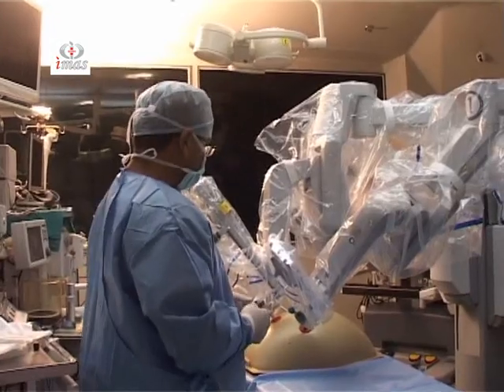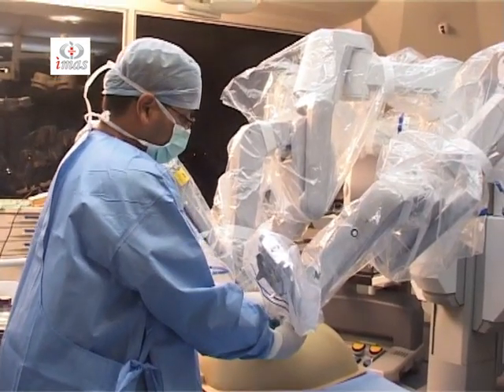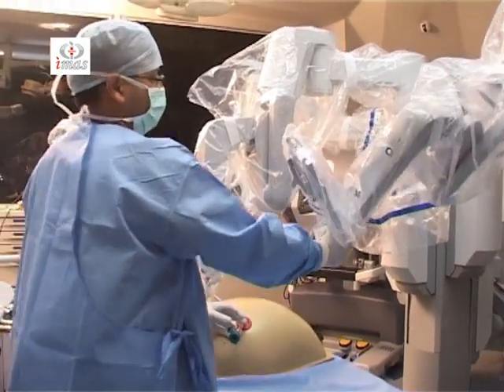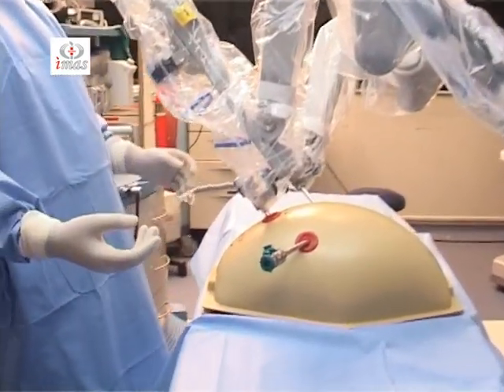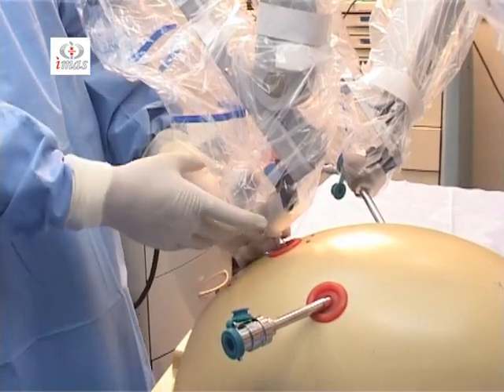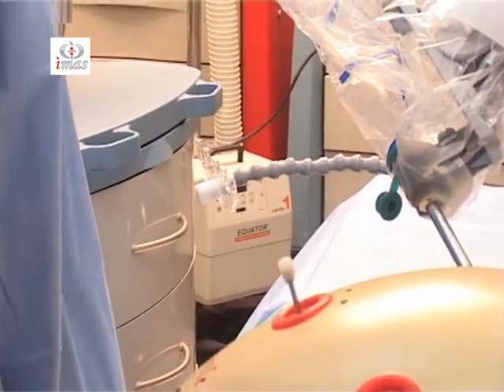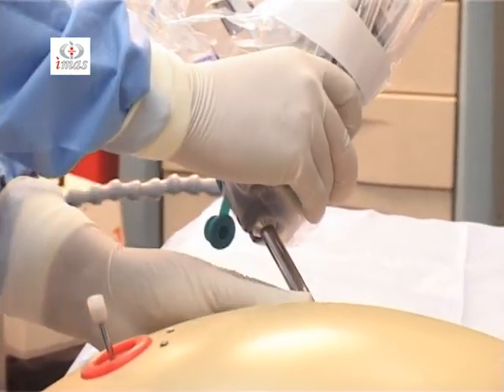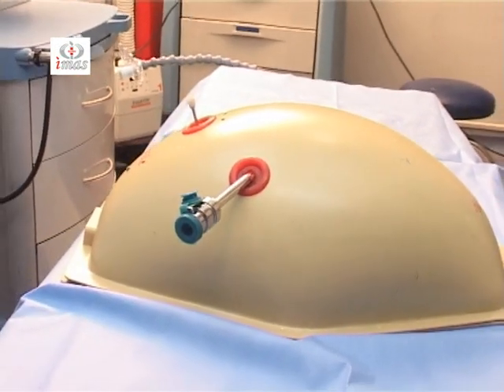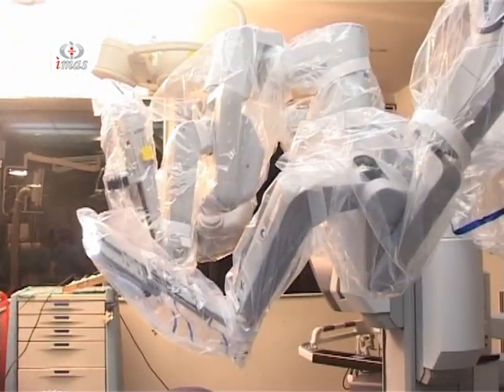To undock this, again, if you come near to me, you can see you have to just open the clips on the quick click cannula mount, press the port clutch button, and you can remove the arm like this. In case you want to do an emergency undocking, in case there is a bleeding or anything like that, you can just press the port clutch button and you can take the whole assembly out in just a moment, like this. So this provides for an emergency undocking of the system, and you can do it in around 30 seconds. You can remove whole of the arms and the port.